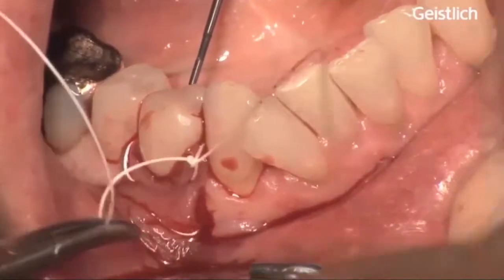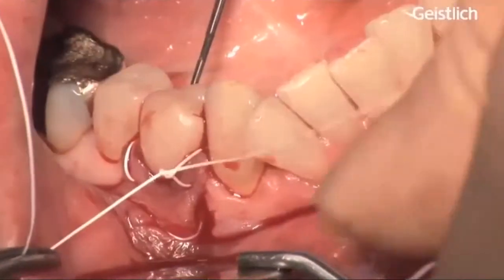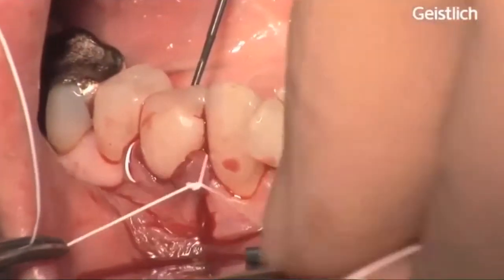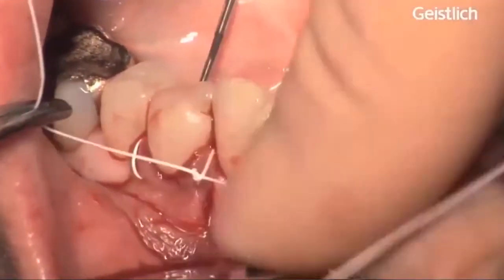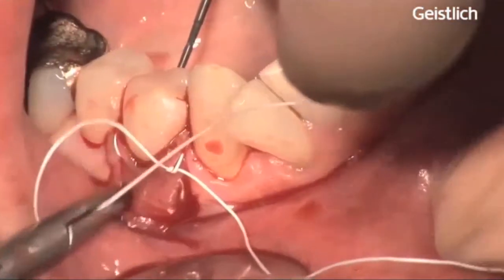The flap margin is now positioned coronally to the CEJ to compensate for post-surgical soft tissue shrinkage. No periodontal dressing is applied.